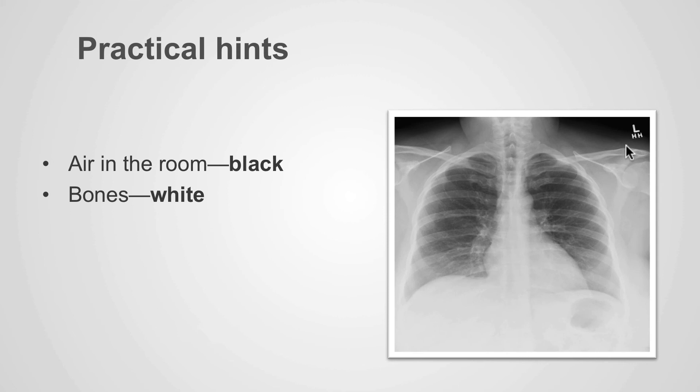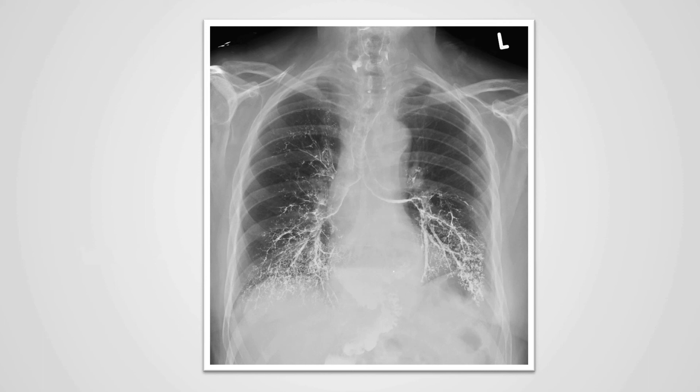We can identify the clavicles and the scapula which are very white. The heart and soft tissues which we can identify readily within the central portion of the x-ray are gray and the markers that are used to identify the location of the patient here in the left upper corner are very white because they're made of lead.